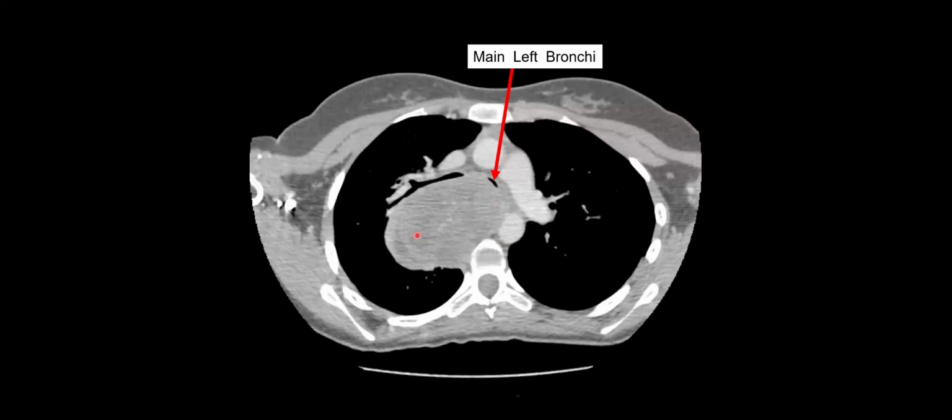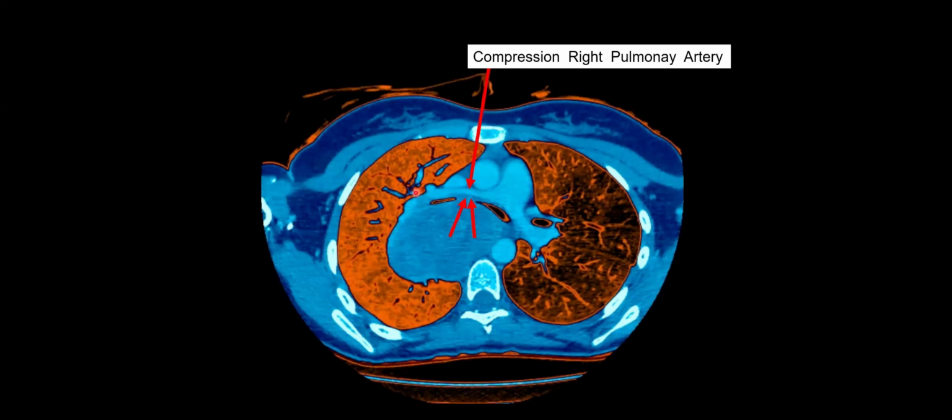In this particular patient, the tumor was obstructing the bronchial tree and also the pulmonary vessels. And the surgeon suspected that this tumor was invading the pulmonary artery. And this was very important because if this was the case, he would like to remove the entire lung.